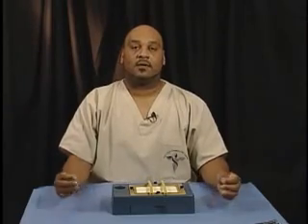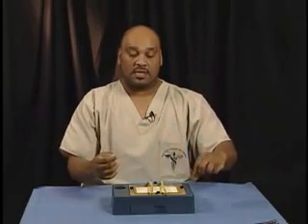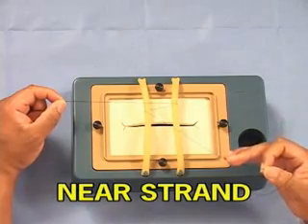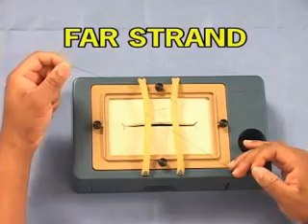Let's look at some key points in performing the one-handed knot. First, we're going to cross our strand. This will set up our first two key points, the near strand and the far strand. If we look down at the strand, the near strand is the strand closest to me, and the far strand is the one further away.